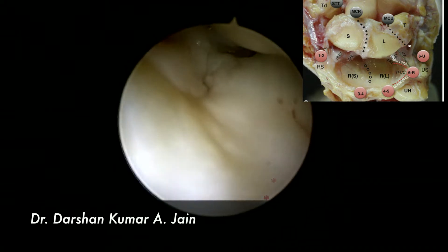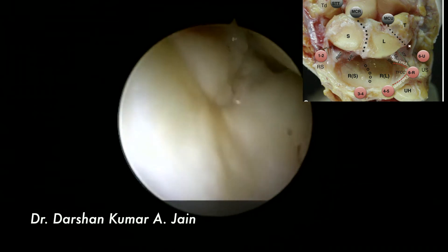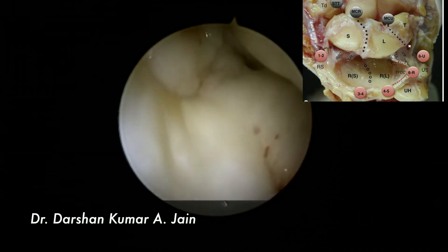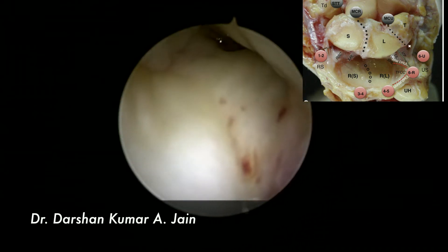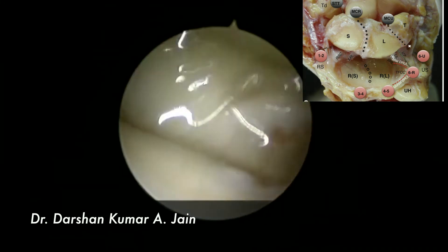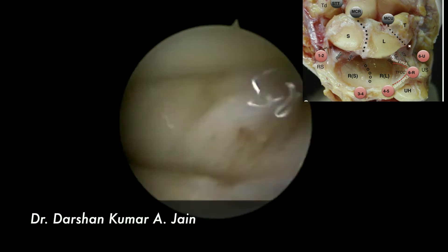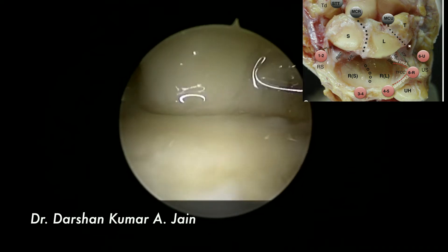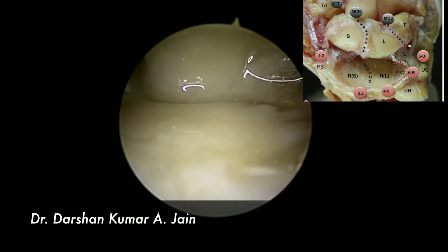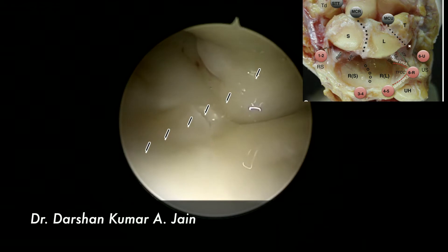There's a small rent which can be seen on the TFCC, as well as the pre-styloid recess there. Going back radially, you can see the radial articular surface, and this is the radial side attachment of the TFCC.